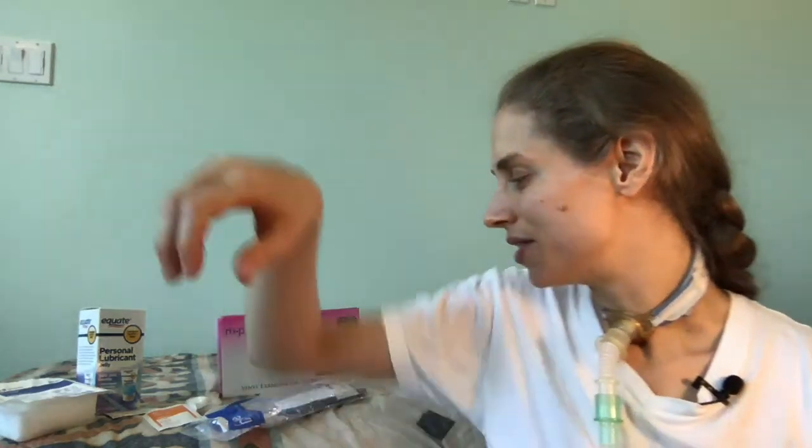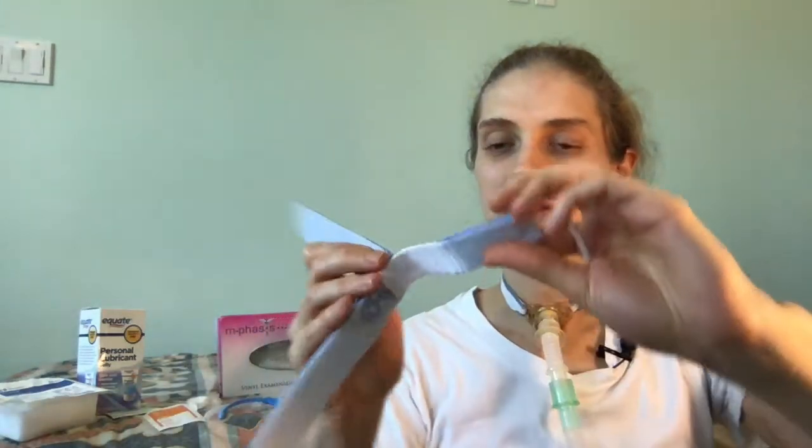And the next thing you need to do is take your tracheostomy tube holder. You're going to want to open it up and take this out, and you're going to see it's in two pieces. There's this long piece and then the shorter piece, and there's this Velcro that attaches the two.